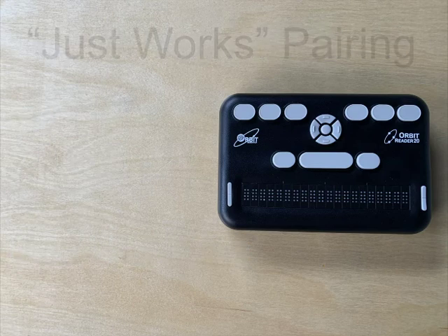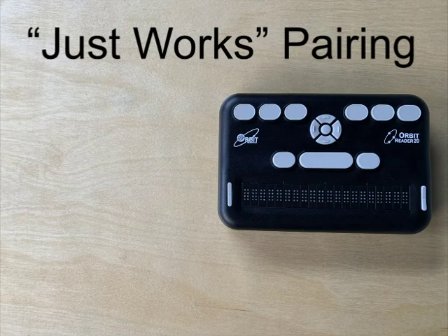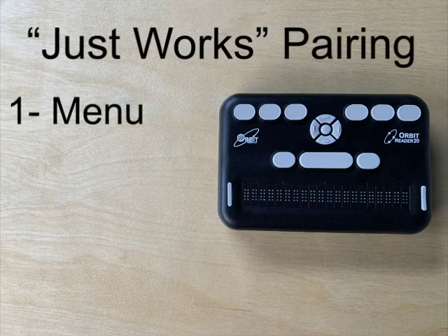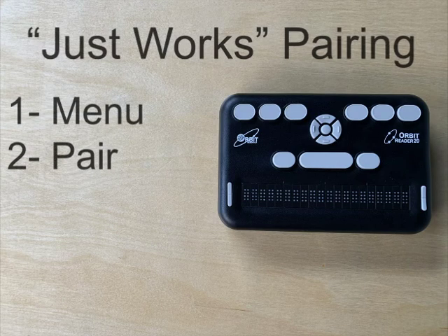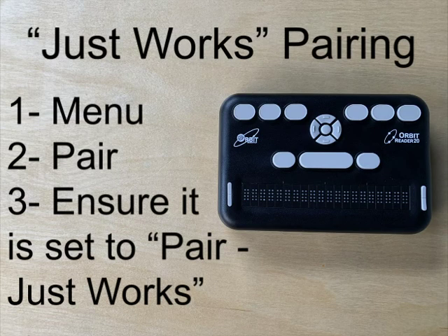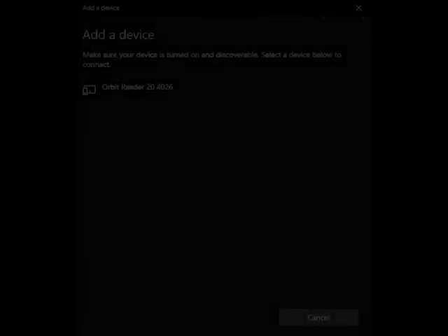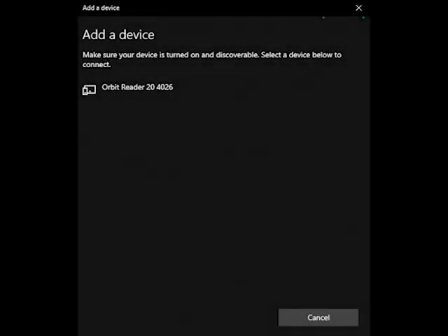To connect with Bluetooth, first ensure that the pairing configuration is set to JustWorks. Note that this is the default configuration. To check, go to the menu on your Orbit Reader 20, then Pair, and there you will see your current configuration. It should be set to Pair JustWorks. On the PC, perform a Bluetooth search, then select the Orbit Reader 20 from the list of devices.